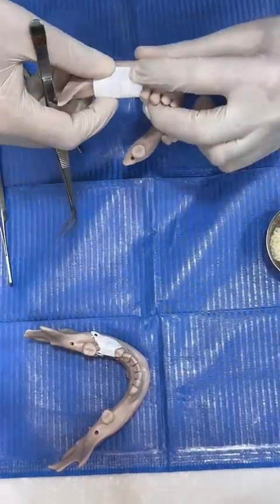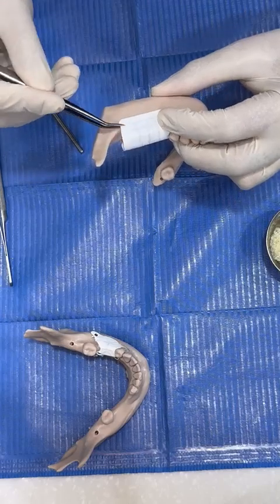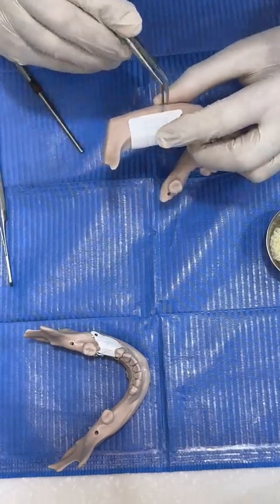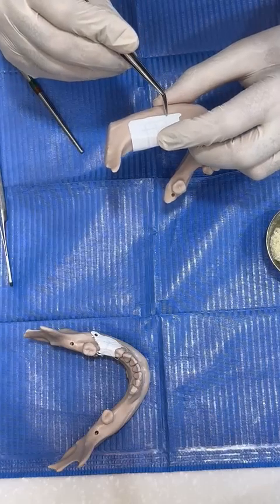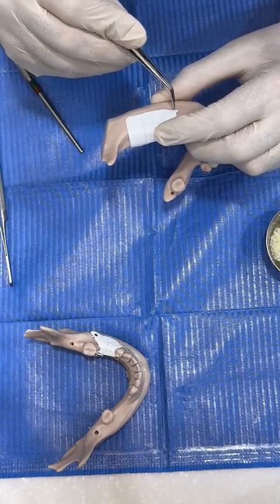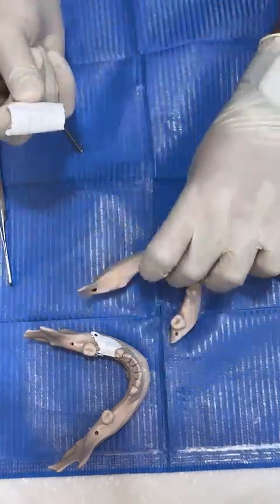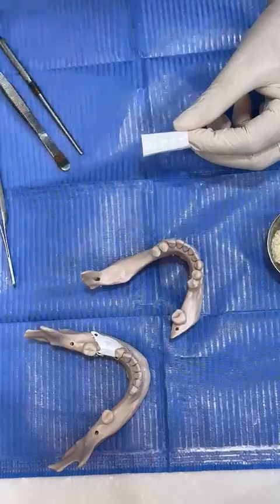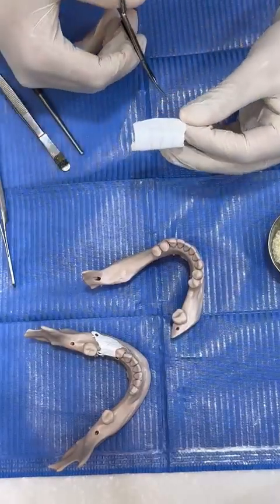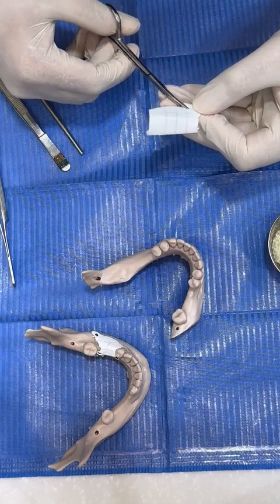And here, again, if you can see, I will check where the mental nerve is. The mental nerve, for example, is here, and I'm going to be here. So I'm going now to make a notch in the membrane to avoid the mental foramen. So I should do this before the surgery. If I have a printed model, I can adapt it, or during the surgery before adaptation and fixation of the membrane.